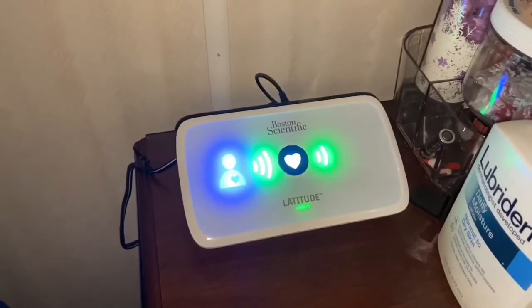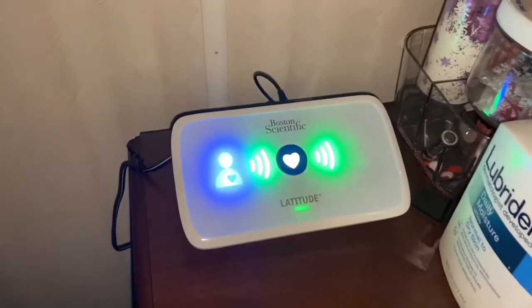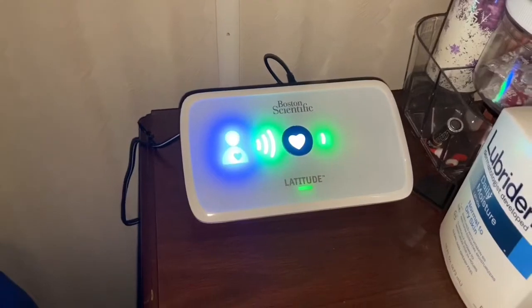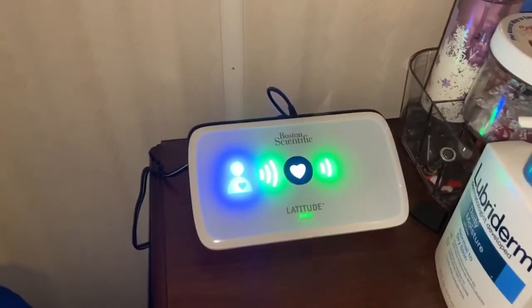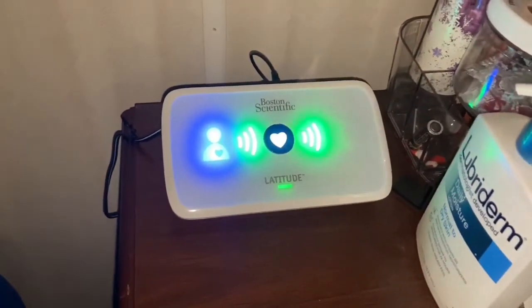So it's sending information to my cardiologist or to the hospital already. And make sure that I keep the communicator plugged in at all times. So it's very high tech.